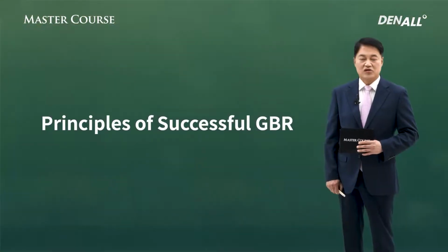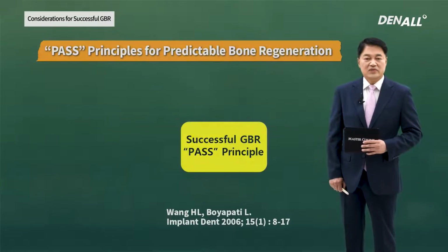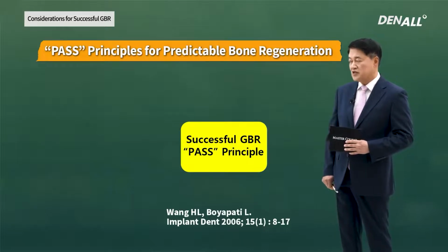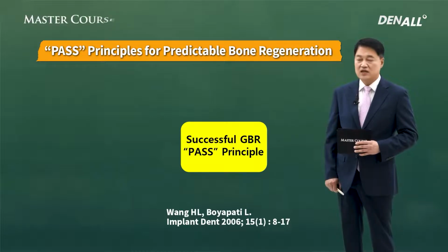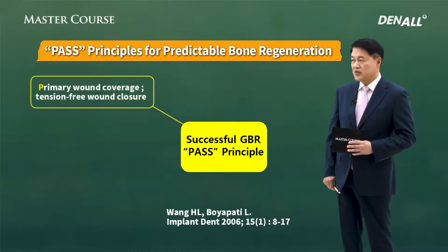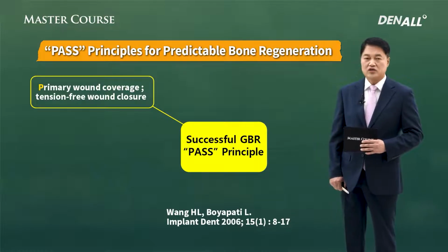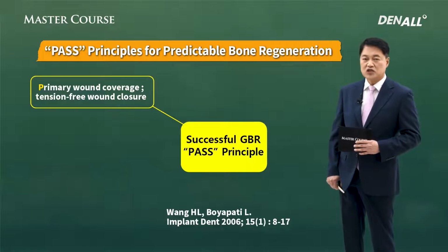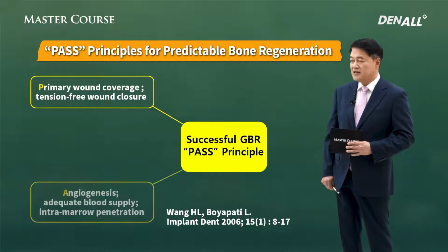Let's look at the principles for successful GBR. In 2006, Wang and others came up with the PASS principle for successful GBR. The first P stands for primary wound coverage. In other words, with tension-free suture, you get primary wound coverage, and that is a condition for successful GBR.